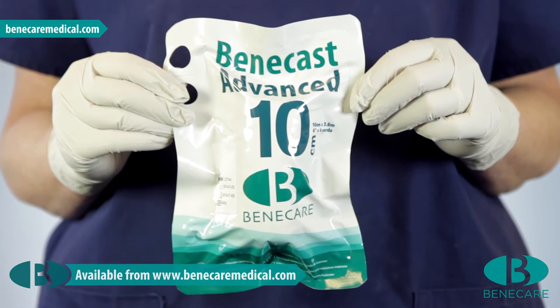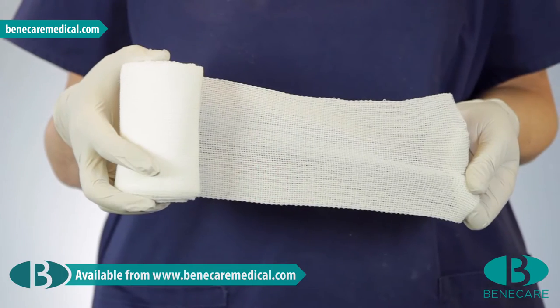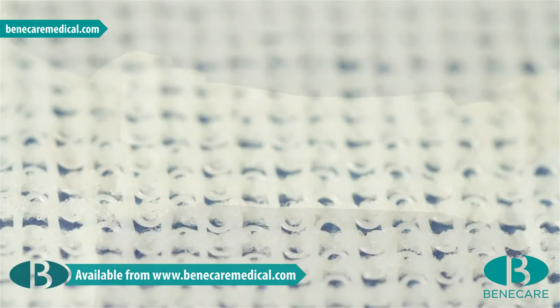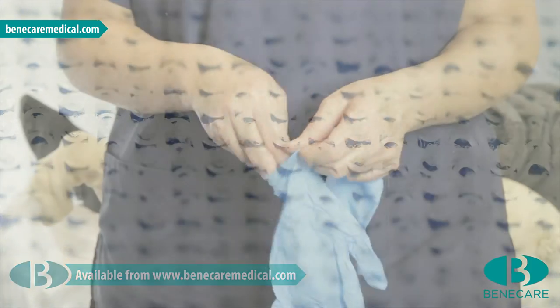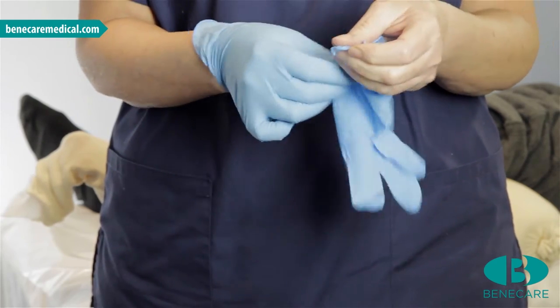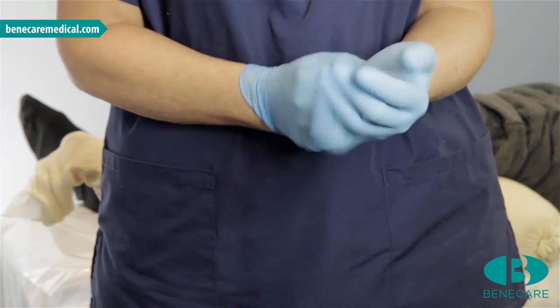The material I am using today is Benecast Advanced, which is a premium casting material with a unique four-way stretch, so therefore ideal for this technique. Apply examination gloves, as it is important when using synthetic casting material to prevent the polyurethane resin from sticking to your skin.